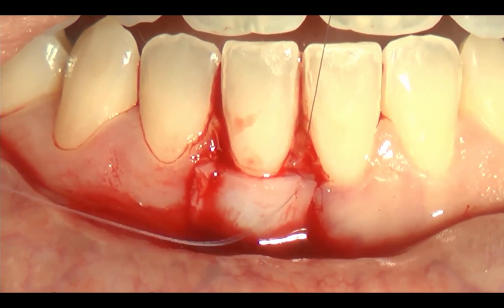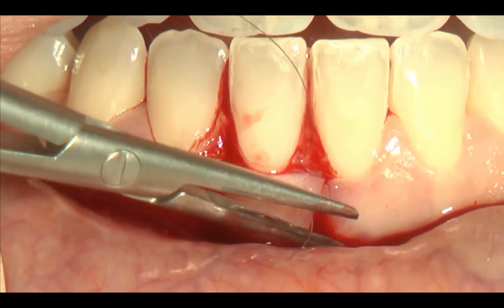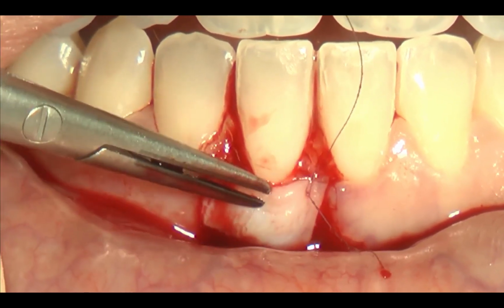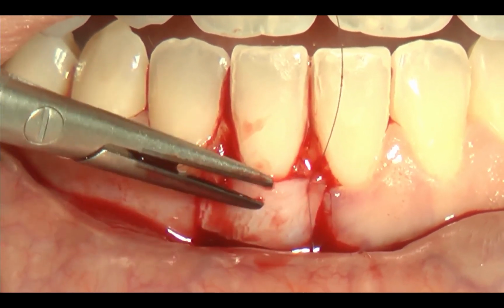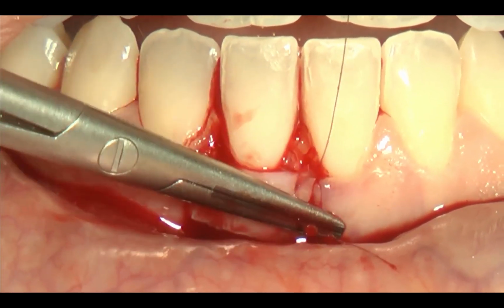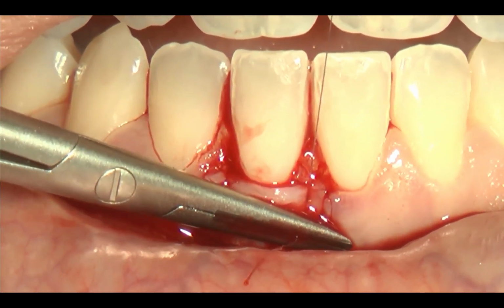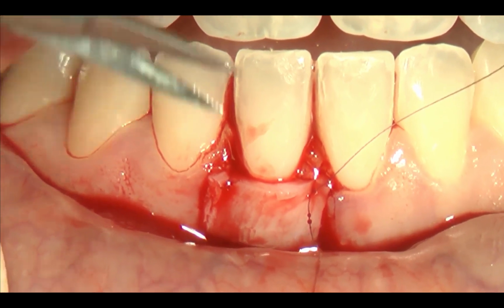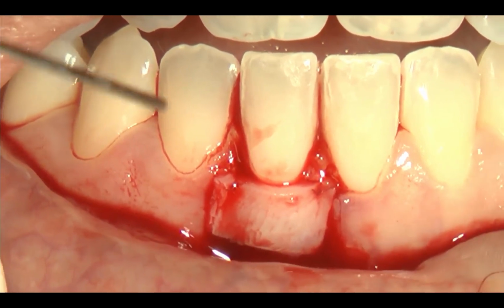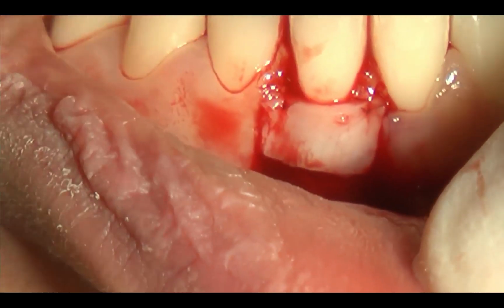Where is the graft, so that you are sure that all the anatomic papillae, de-epithelialized, are completely free for the surgical papilla of the coronally advanced flap. Okay, now you see that the graft was placed in position.